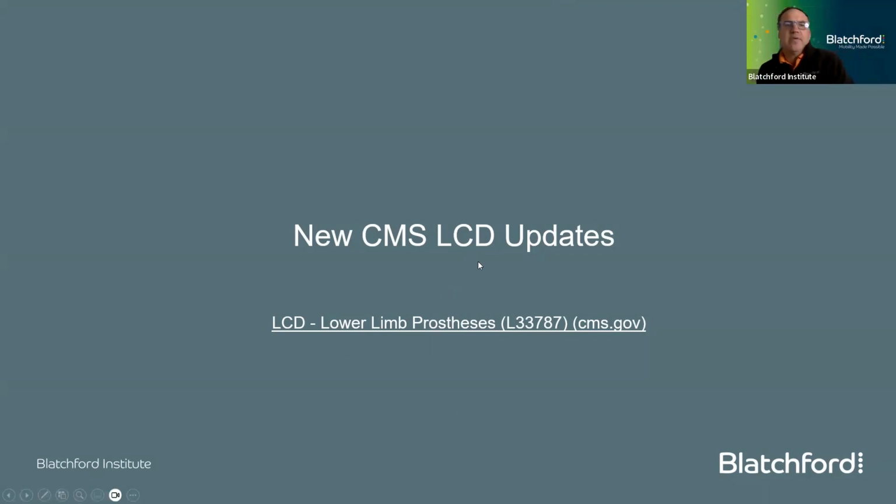But yes, we're going to be pivoting now and talking a little bit about the new Medicare update, and specifically, how does it apply to the Orion 3? First off, if you have not read the LCD, I highly recommend it. It's got a lot of information in there that you may not realize. For instance, in the policy article, they went into a lot of description on the K levels and what it means, and what a typical K3 ambulator looks like, typical activities of a K3 ambulator or a K2 ambulator. Some of that information was surprising. It doesn't say anything specifically about not being able to use an assistive device, for instance. You can be K3 and still use an assistive device. So it's got a lot of really good information if you have not taken a look at it.